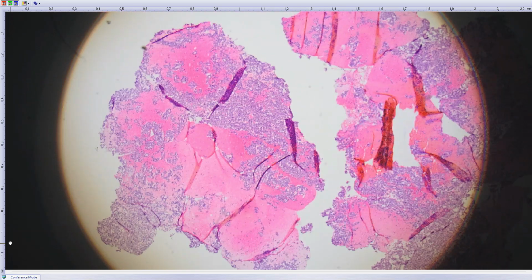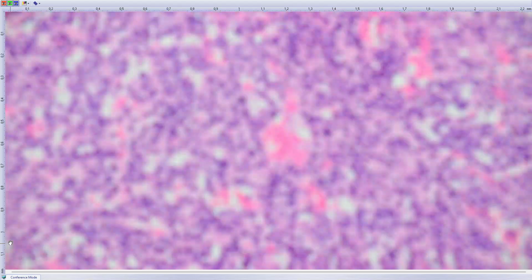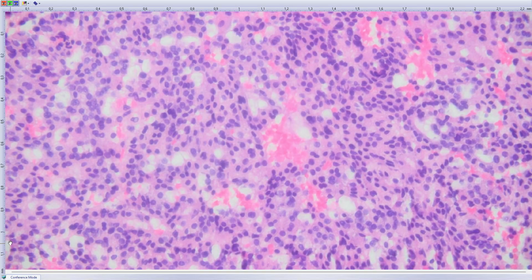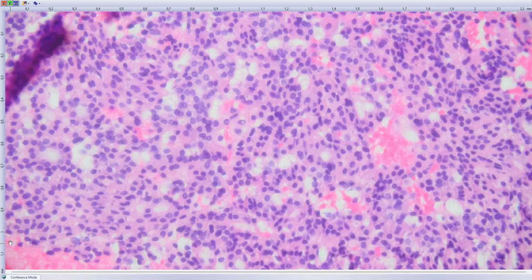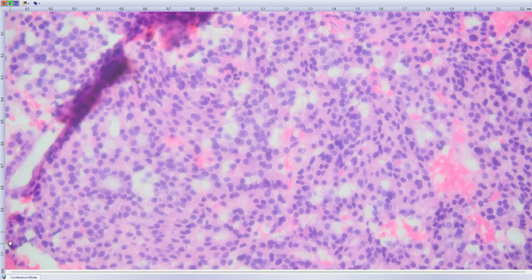But the morphology is essentially the same. So this is very basic, easy. This acinar-like proliferation, maybe some, I'm not sure, salt and pepper chromatin, maybe not. But the tumor is positive for all neuroendocrine markers, and proliferation index was very low, below 1%. So this is a grade 1, well-differentiated neuroendocrine tumor. Okay, easy one. NET grade 1. The duodenum.